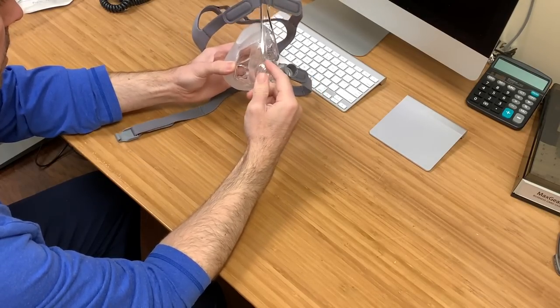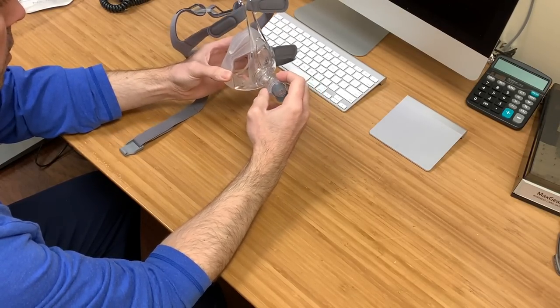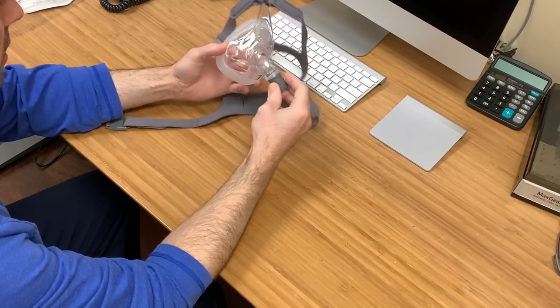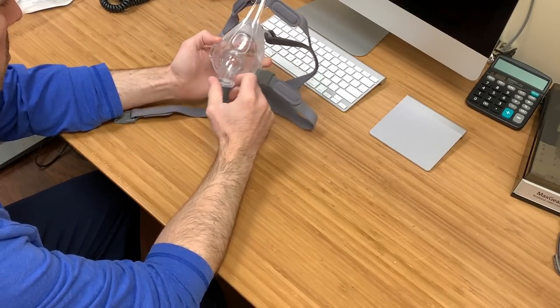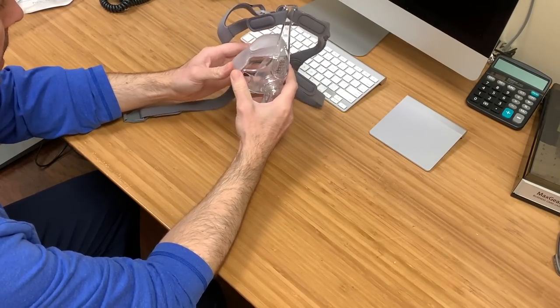And the only thing I don't like is that the swivel doesn't detach like other manufacturers. It'll swivel 360 degrees, no problem, but it doesn't come off. I say that's the only thing I do not like.